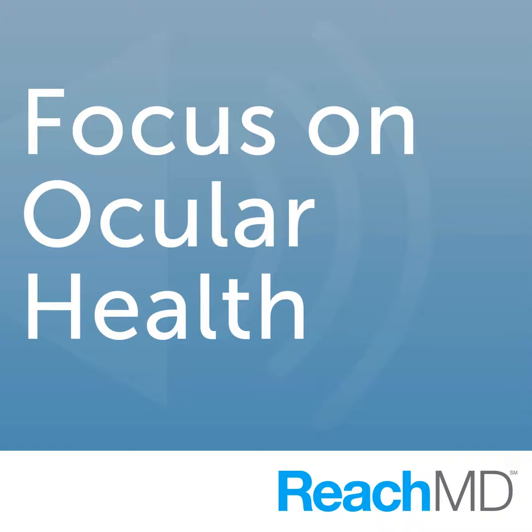And in a diabetic patient that has swelling in the macular area, is this OCT useful there? It's very useful, and one of the problems with diabetic patients is that, unlike in macular degeneration where it tends to start in one spot, oftentimes in diabetic patients there will be multiple areas that are involved, corresponding to different lesions on different blood vessels. One of the difficulties that people have had in the past when they first developed photocoagulation for treatment of macular disease was trying to assess whether the retina was swollen or not.